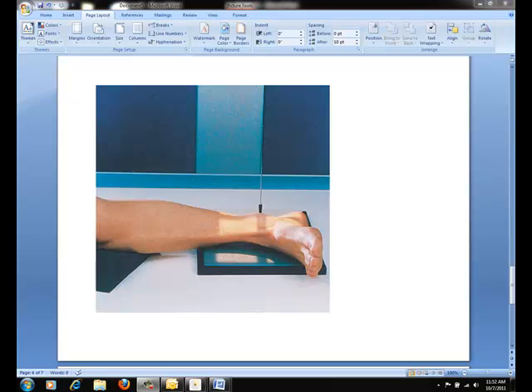Dorsiflexion is required to prevent the lateral rotation of the ankle. You may now direct the central ray perpendicular to the ankle joint, entering at the medial malleolus. Collimation should be the same, 1 inch on the sides of the ankle and 8 inches lengthwise, but be sure to include the heel and the 5th metatarsal base.